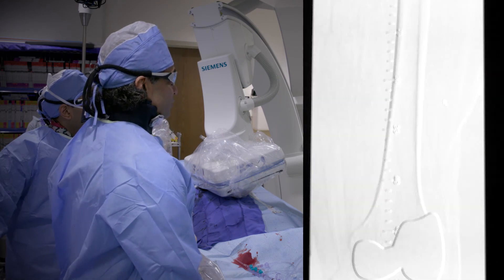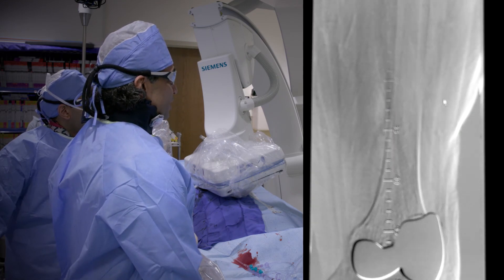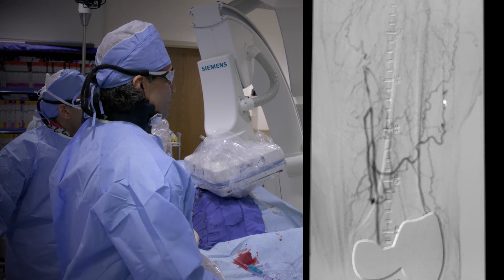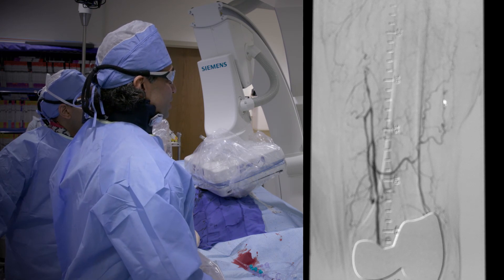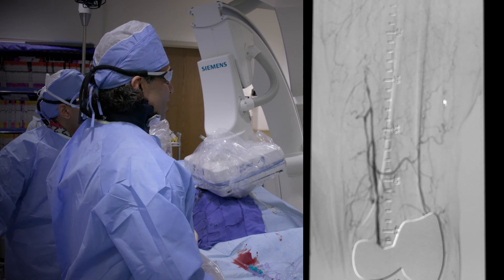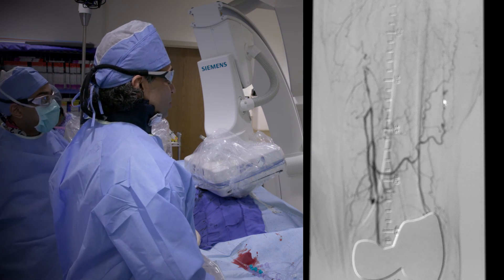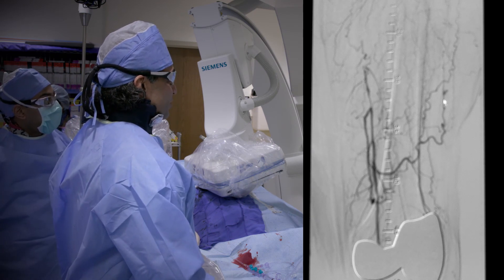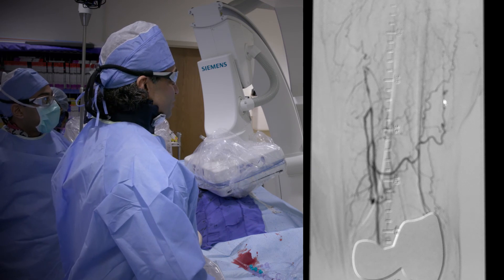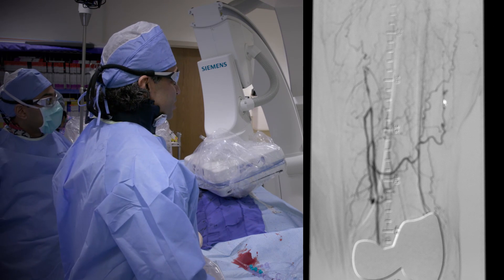As we continue to move down the leg, you see that the SFA comes back at around 29. And it's still severely diseased at 29. So we have to be aware of that because it's still possible that we can go into a sub-intimal plane here.